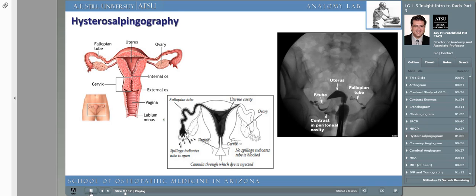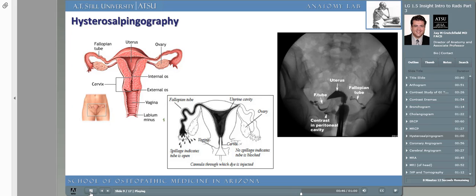A hysterosalpingogram is an invasive gynecological test to assess for causes of infertility. Once we understand the anatomy of the cervix, the endometrium of the uterus, and whether the fallopian tubes are patent, we can infer causes of infertility. The middle image shows a blocked fallopian tube on the patient's left, whether from cancer, prior surgery, or congenital malformation — indicating the patient has only one properly functioning oviduct. Hysterosalpingography has mostly been replaced by hysteroscopy, the use of a fiber optic endoscope inserted into the uterus and into each fallopian tube to assess for abnormalities of the female reproductive system.